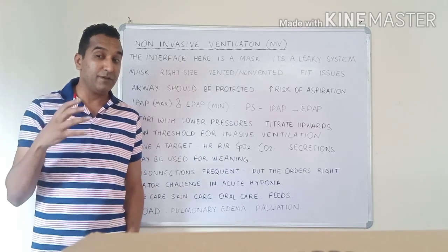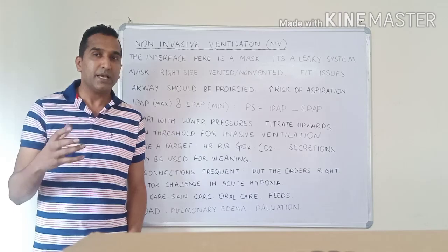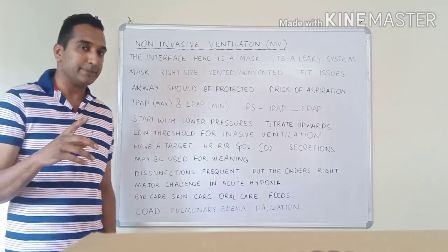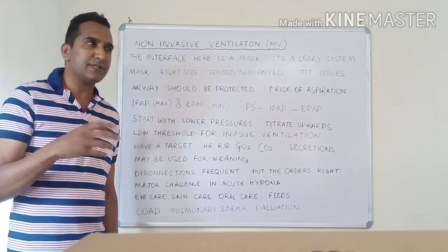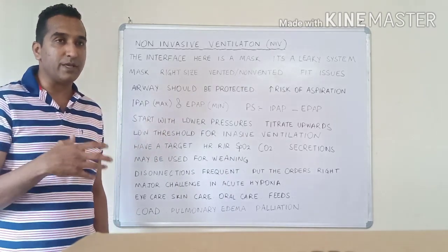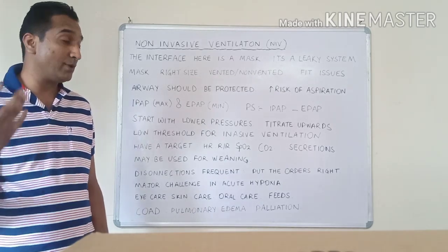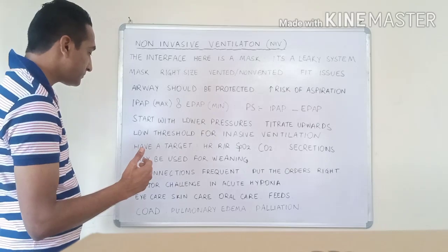You can do that if you can really communicate well with your patient. He tolerates it, yes, but these are unusual cases. Otherwise, generally it's an intermittent therapy. For some patients we may use it just at night maybe, and some patients we may use intermittently during the daytime or not at all. That depends on the clinical condition of the patient.